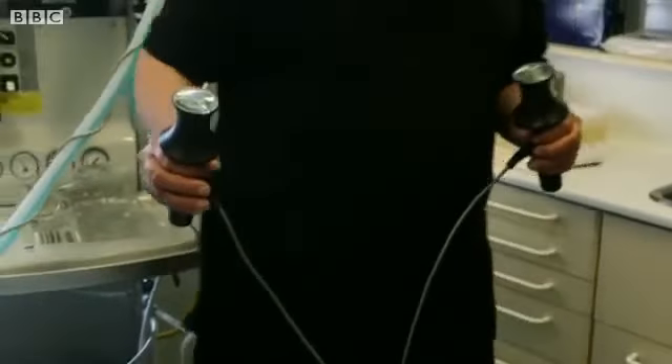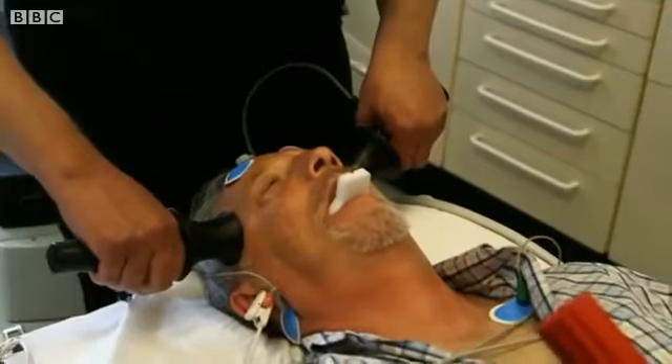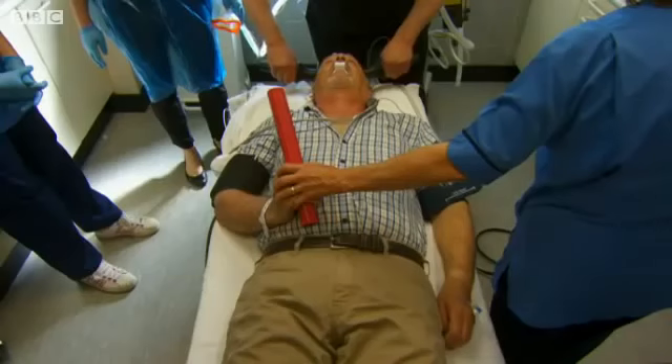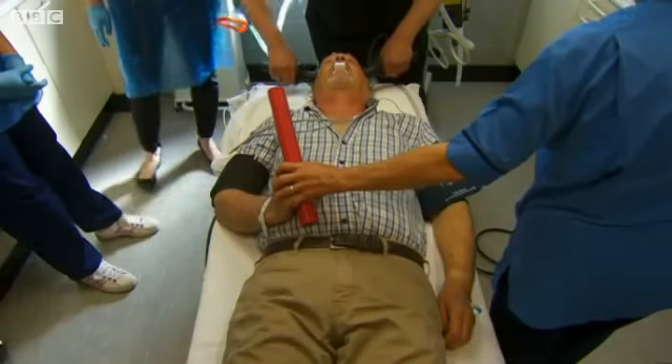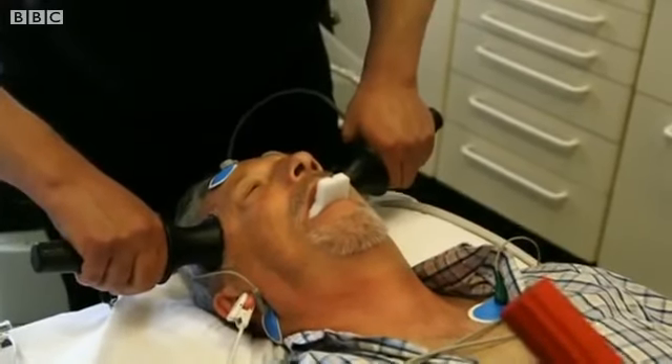I was in a position to put the electrodes on each side of his head and initiate the seizure by passing the electric current.